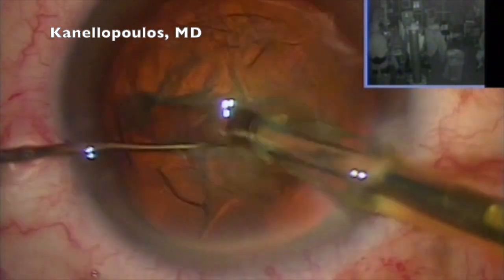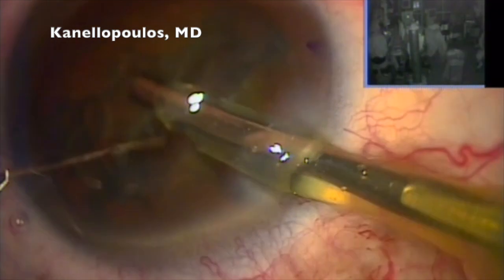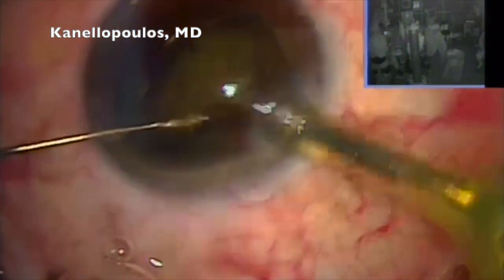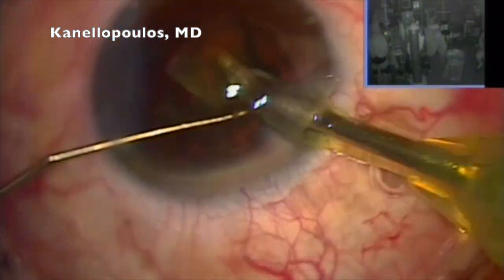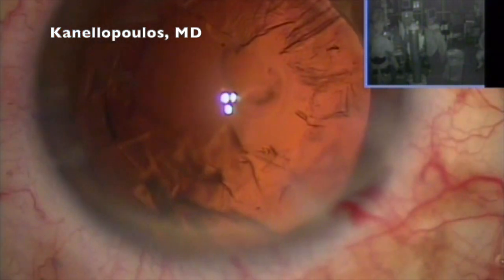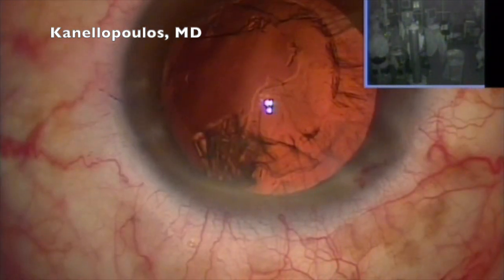We're going to split the lens in half, and then in quarters. The Signature device is my go-to device as I'm achieving the least possible energy. Refilling here with viscoelastic — very key in avoiding an inadvertent cut of the capsule, which we did see here for a second.